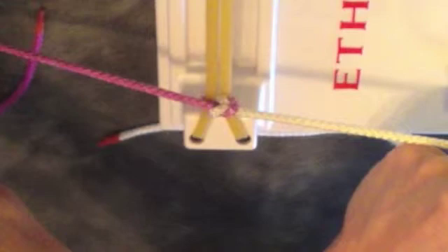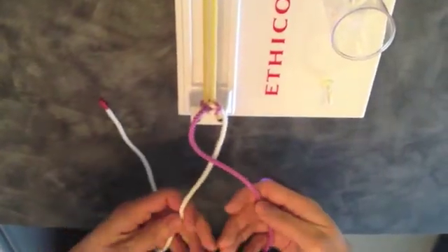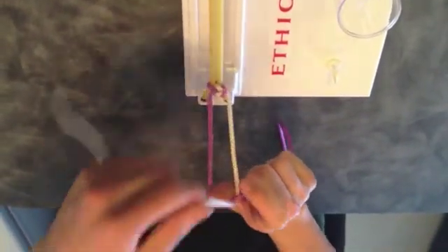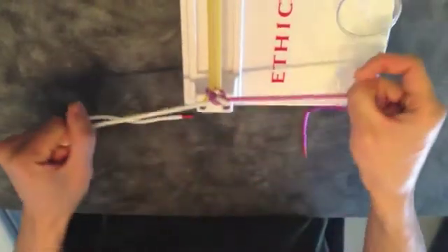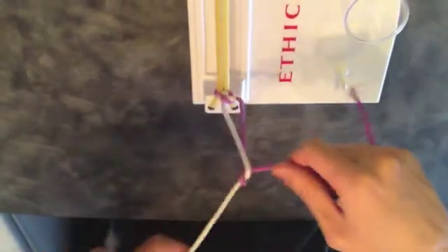The resulting knot should lie flat against the surface and look something like this. Repeat the process until you have enough throws to create a secure knot. According to Tidwell et al., a secure square knot requires at least 4 throws and may need as many as 6 throws. In practice, you should use as many throws as the surgeon you're working under wants you to use.